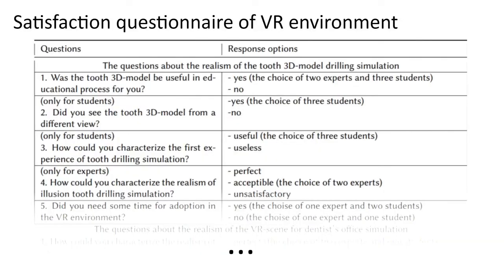Unfortunately, during the pandemic period, the experimental part was restricted. 2 experts and 3 students from the Faculty of Dentistry at the Vernadsky Crimean Federal University participated in the testing of pilot version of VR simulator in dental education. They evaluated the realism of the tooth 3D model drilling simulation and the realism of VR scene of dentist office simulation based on questionnaire demonstrated in table.